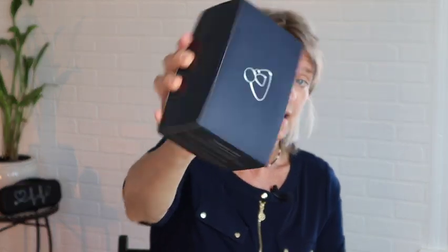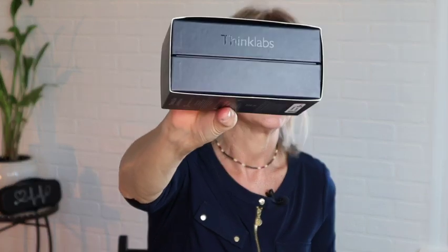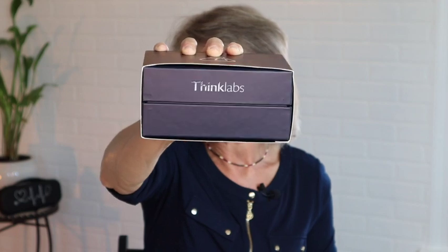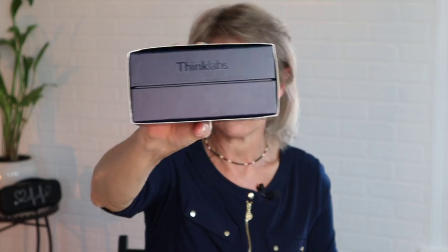First thing I have is the ThinkLab box — ThinkLab. I have to make sure I say that because sometimes I say ThinkLabs, so excuse me if I do. I do want to make sure the content of my videos and my opinions are not paid by anybody on the outside, so I bought everything myself. Let's go ahead and open this baby up.